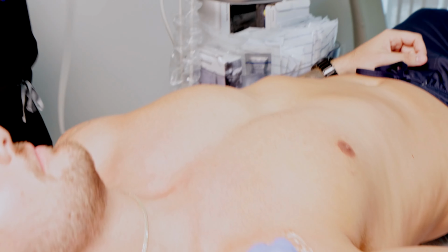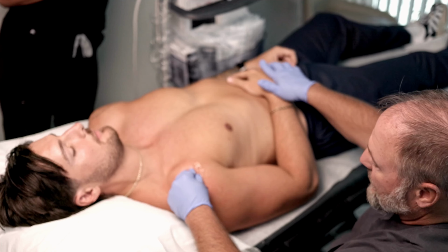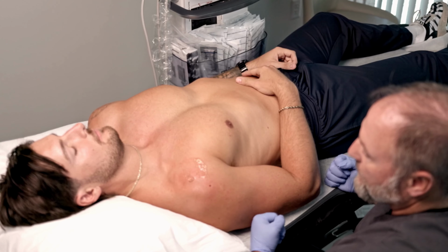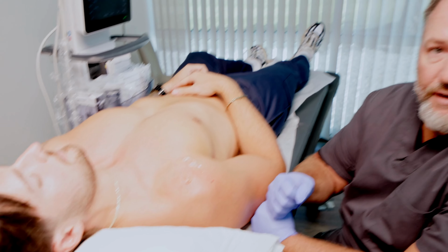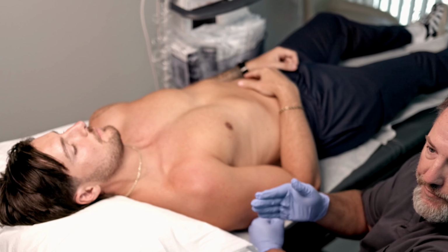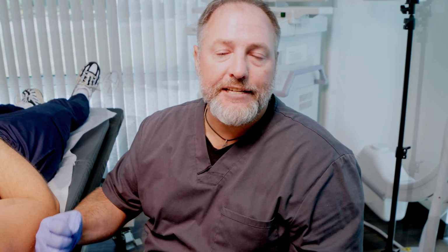All right, so we're just going to do a little bit of work to get you back into that neutral plane of motion here. We'll get you cleaned off here. So we were able to, as you can see, find a focal area, a partial tear of the subscapularis on the articular surface. So that's consistent with his symptoms and pain, and this is where we were looking in that area for the site of pathology. Easy to get to with direct communication there.